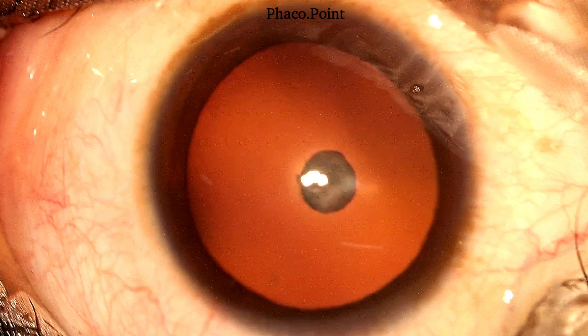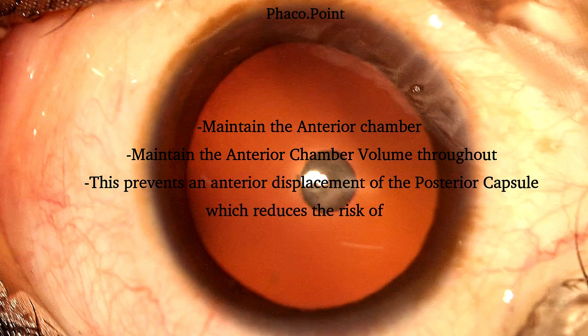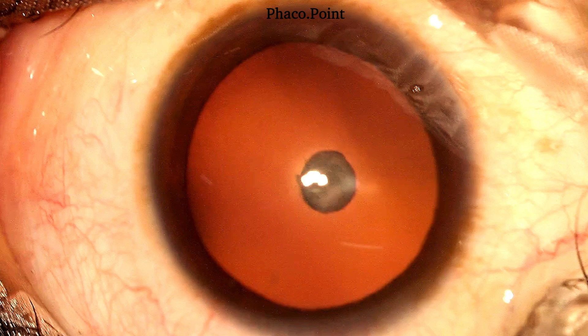During each step of posterior polar cataract surgery, we make sure that we don't let the anterior chamber shallow. We maintain the anterior chamber volume consistently, which prevents unnecessary fluctuations in the posterior capsule and thereby minimizes the chances of having a posterior capsular rupture.